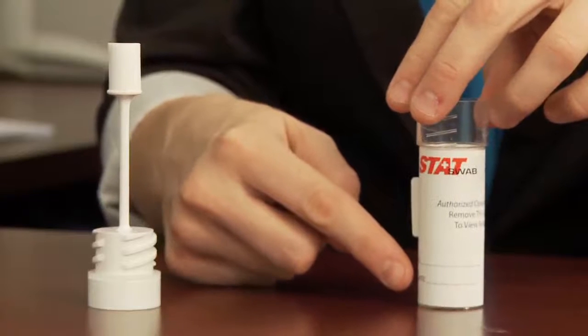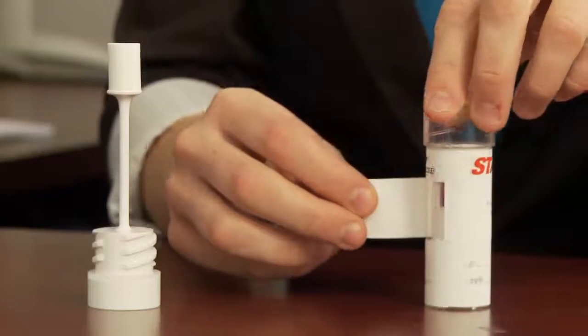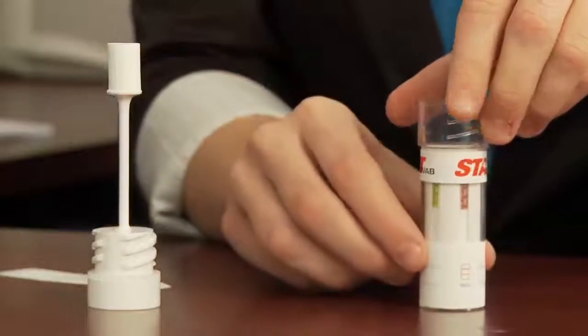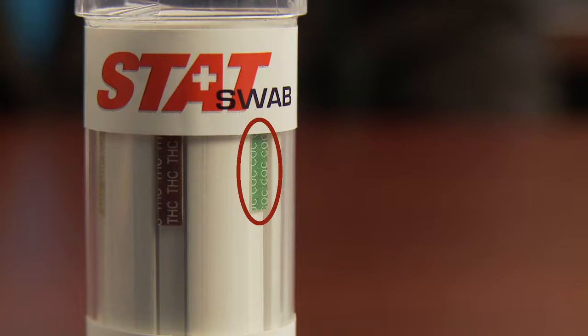The STATSWAB also includes a perforated removable label that allows the administrator to view the test results. Test strips should be visible in the test window, where test result lines will appear for interpretation. Each strip is also labeled with the abbreviation for the corresponding drug that it will indicate for.